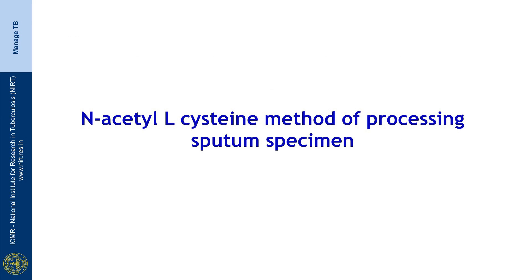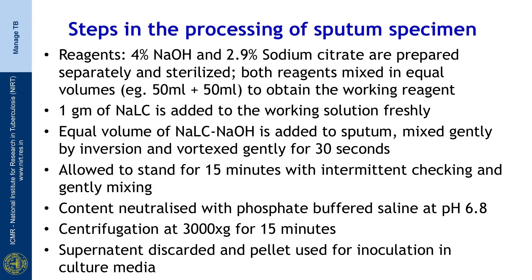In this demonstration we will be looking at the N-acetyl-L-cysteine method of sputum processing. The steps involved are: first, we prepare the reagents — 4 percent sodium hydroxide and 2.9 percent sodium citrate — which are prepared separately and sterilized. Both reagents are then mixed in equal volumes, for example 50 ml plus 50 ml, to obtain the working reagent.